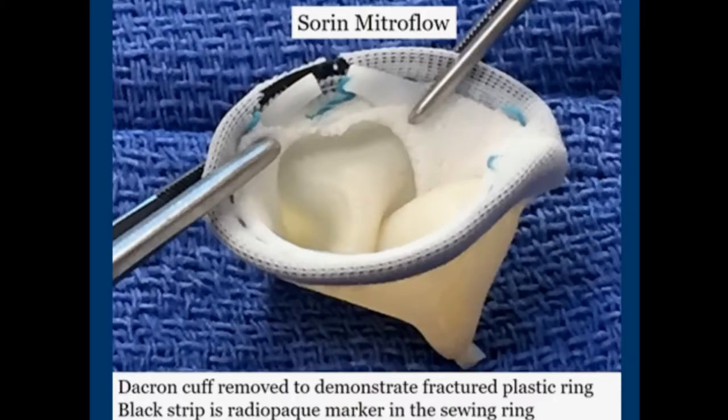Perhaps that was this, but I will tell you that we've done a Mitra-Flow where we did have a small periaortic hematoma. Okay. That, the patient... We don't want that in our series. Okay, that's fine. I'm just kidding. The patient did fine, but it was obvious periaortic hematoma. A little small effusion, gave some protamine, kept the patient intubated one day, and the patient did fine ultimately, but it was with Mitra-Flow. And so that was one thing.